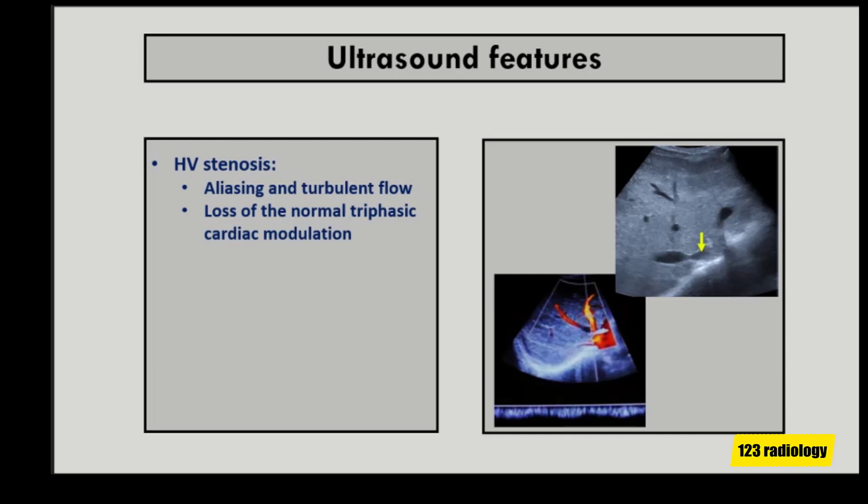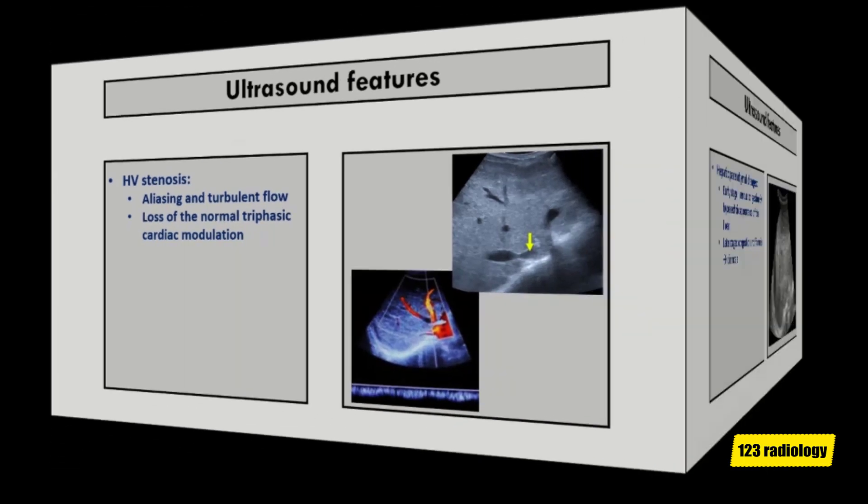On color Doppler ultrasound, stenosis is manifested by aliasing effect and turbulent flow, with loss of the normal triphasic cardiac modulation, as you can see in this image.